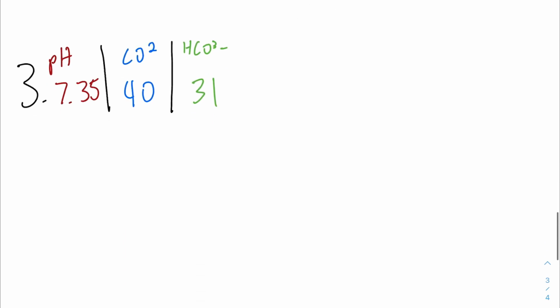Okay, let's look at another one. So boom, we look at the pH. Is it within normal range? Yes.